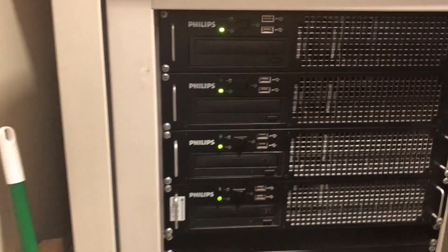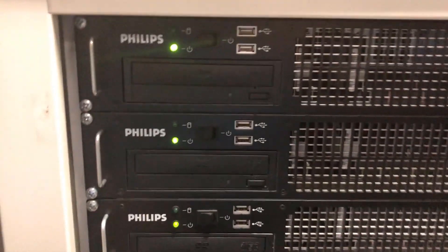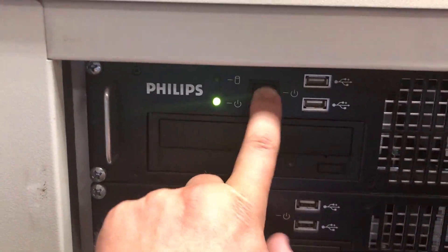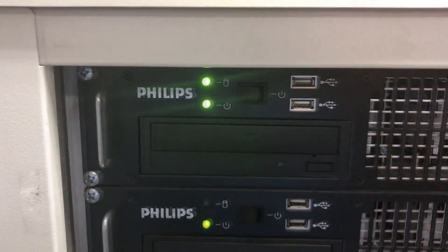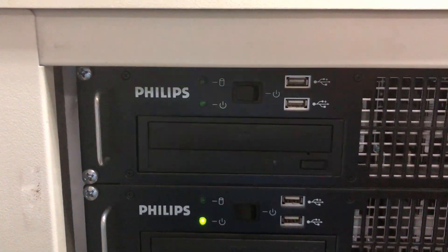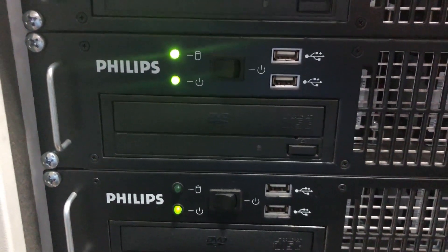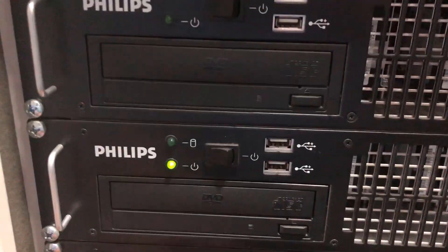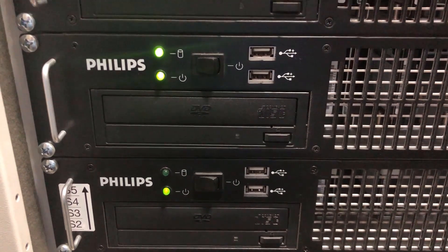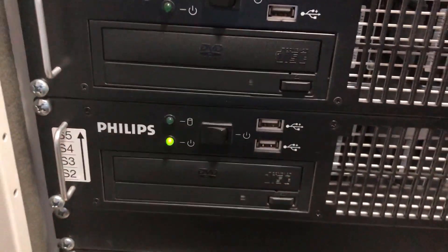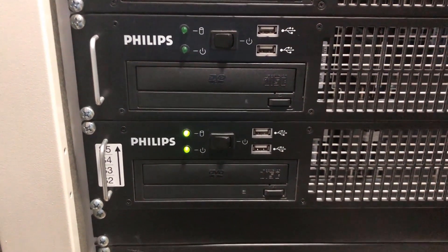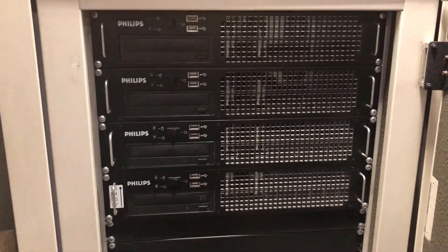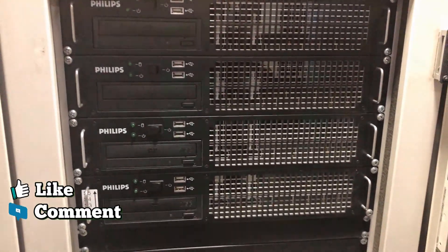Let's see the servers here. To turn the servers off, you're going to double tap each toggle switch. Just ensure that all of the servers lights are off.